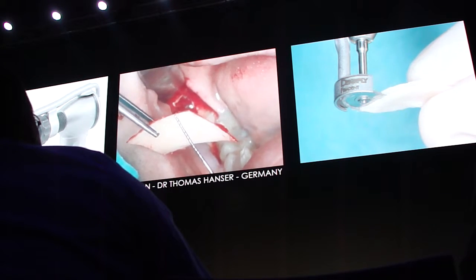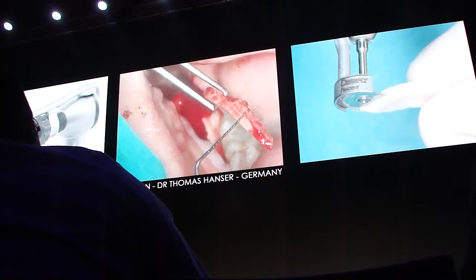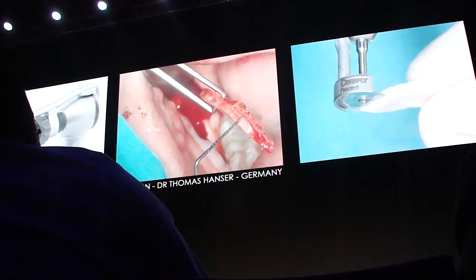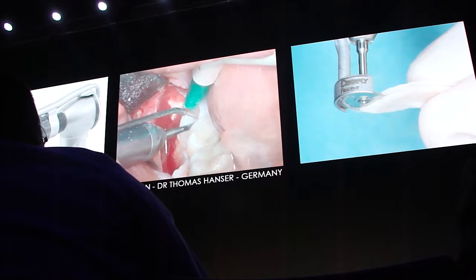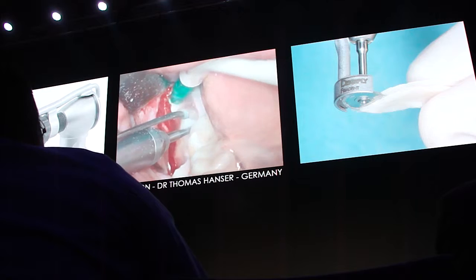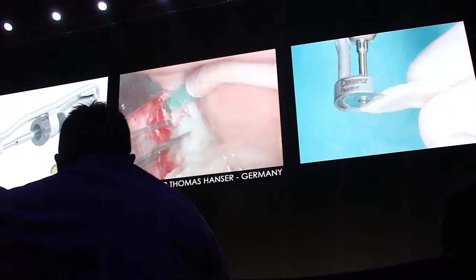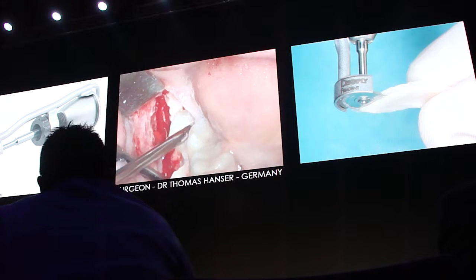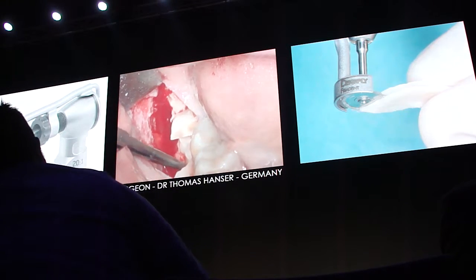So remember, there was a wisdom tooth impacted in the bone, and instead of removing the bone with a large drill, we are collecting the bone. And you can see the very superficial osteotomies coming from the microsaw. But now after removing this bone, we have a beautiful access to the wisdom tooth. We are easily able to now remove it, but still having the bone graft left.